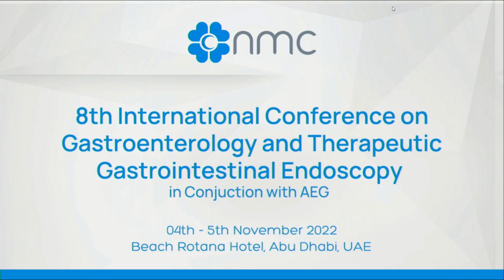Another thing, this risk of tract seeding or needle tract seeding is extremely uncommon. There are few case reports of it, because with the thin needle which you use, the chance of tracking is very low, because there is a sheath which covers the needle. That sheath comes out of the scope when you are doing FNA, and only the needle comes out of that sheath, goes and punctures the tumor, and then the needle goes back into the sheath and you remove the entire sheath. Of course, there are certain case reports, but it is extremely uncommon to have tumor seeding during the procedure.